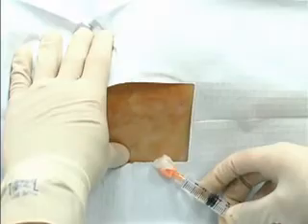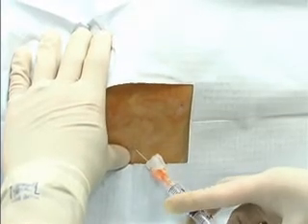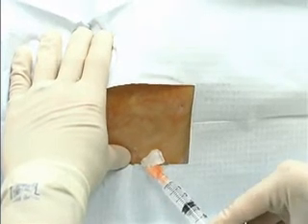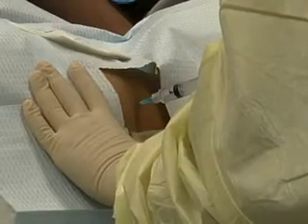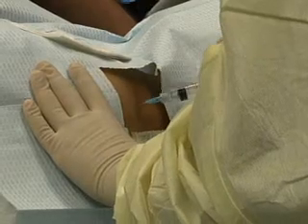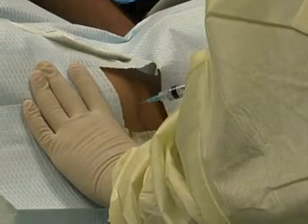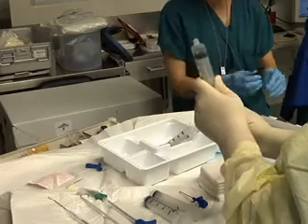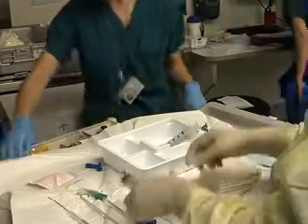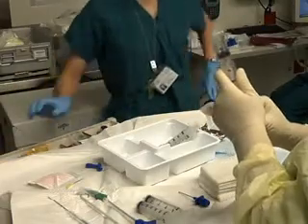After sterile preparation, 1% lidocaine should be slowly injected to raise a wheal over the biopsy site. Then infiltrate the periosteum with 2 to 5 milliliters of buffered lidocaine. In the awake patient, ensure the adequacy of local anesthesia by gently tapping the periosteum with the tip of the needle used to deliver the anesthetic. Be sure that you have prepared the appropriate number of 30-milliliter syringes with and without heparin prior to starting the bone marrow aspiration.